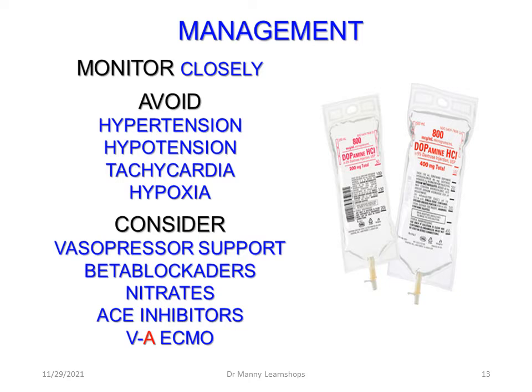Consider beta blockers, nitrates, angiotensin converting enzyme inhibitors, ACE, and possibly a change from V-V ECMO to V-A ECMO in extreme situations.